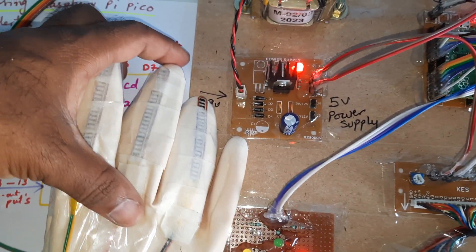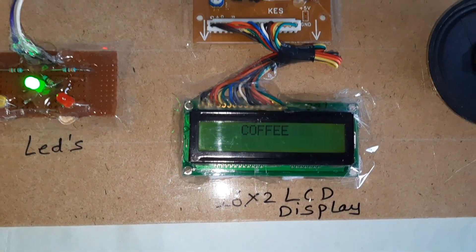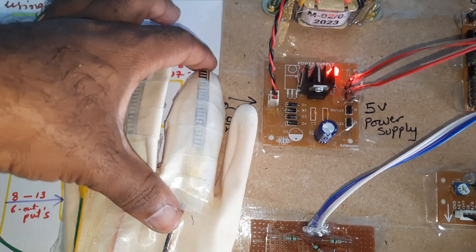Demonstration of gesture recognition: bending the fingers triggers voice output 'teeth.' Bending another gesture plays 'coffee.'